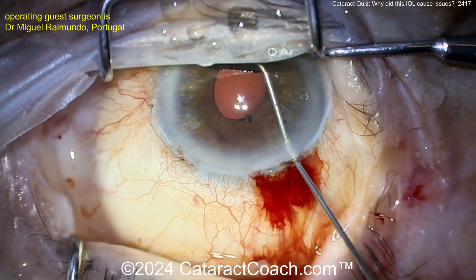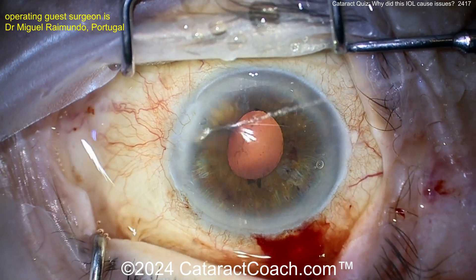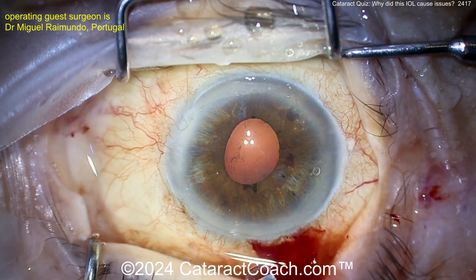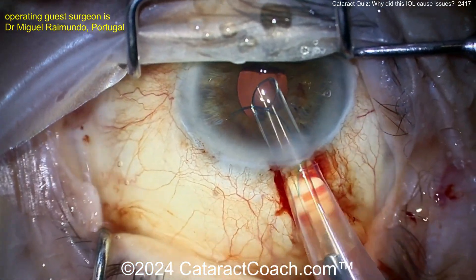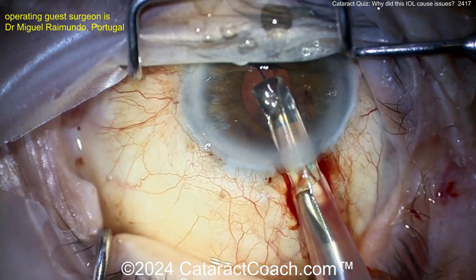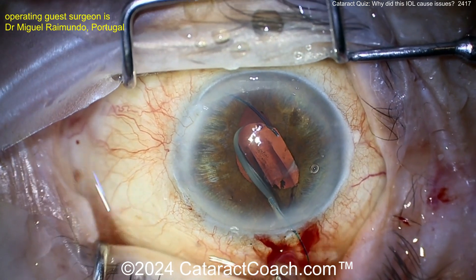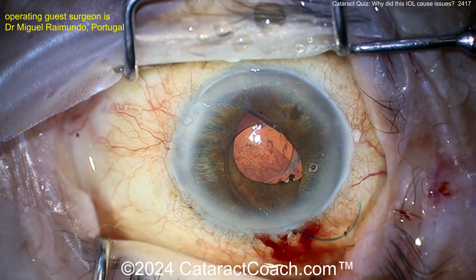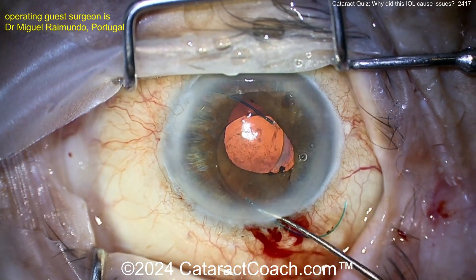A little more viscoelastic is going in, opening things up and giving some space. Here comes a new lens — it looks like a three-piece lens. There it is: the 7L rule. The leading haptic looks like the number seven, then there's the optic. Putting it on top of the iris first — I like that idea because then you can dial it into whatever orientation you want afterwards.